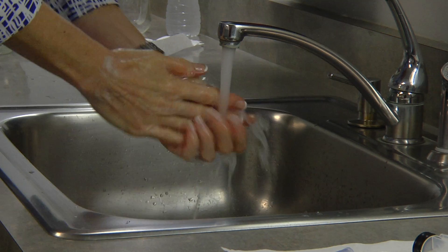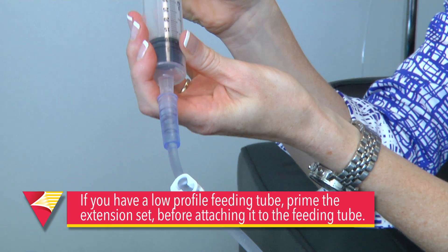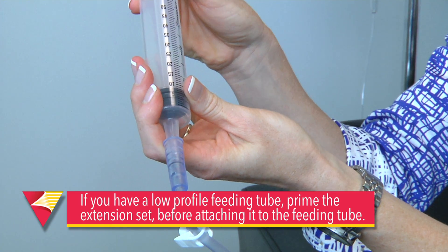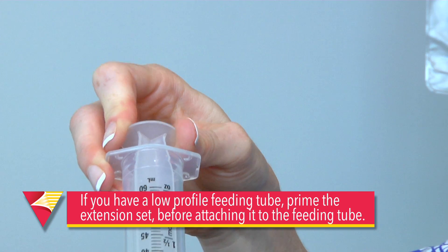Always wash your hands before handling your tube or any supplies. If you have a low profile feeding tube, the first thing you need to do is prime the extension set before attaching it to the feeding tube.